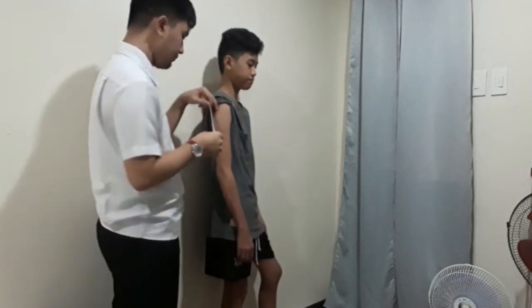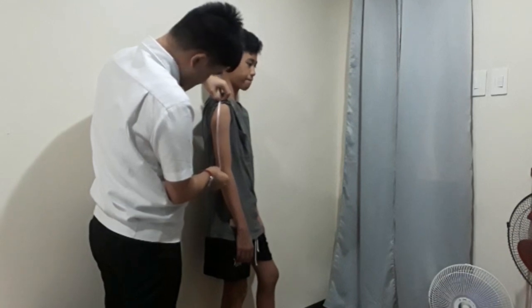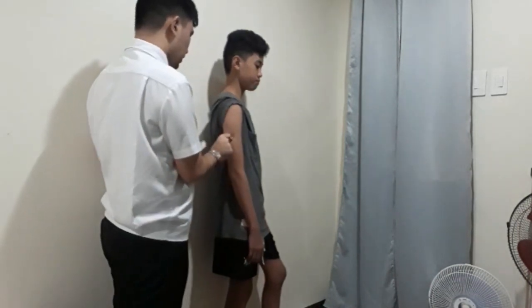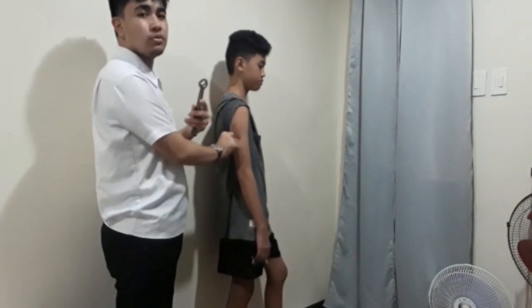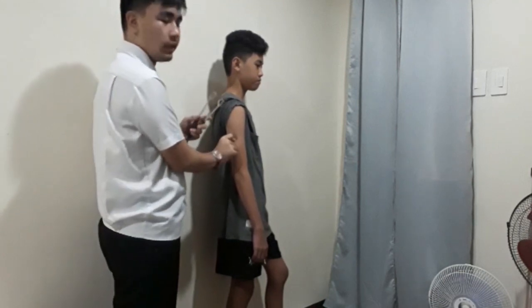So it's 30 cm, so the midpoint is 15. This is the midpoint. So now, we'll pinch it to let the muscles relax. And in doing this, we need to use the non-dominant hand, which is the left hand for the client.